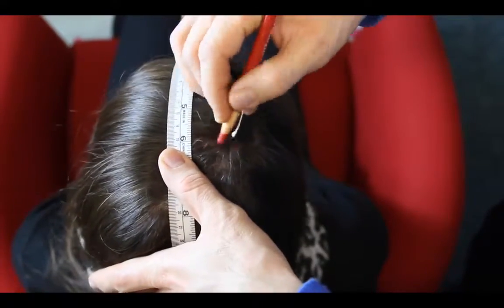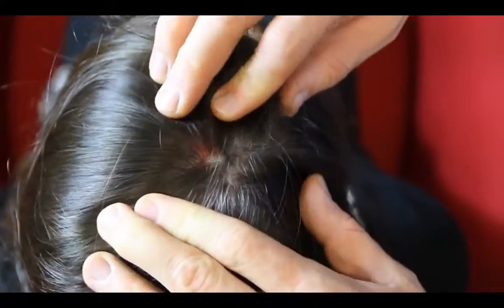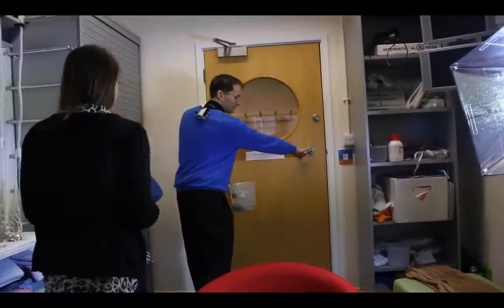The 2 marks you've just made should form an X in the exact center of the participant's head. This will be important later. For now, we're done with this phase and ready to head next door to start recording.